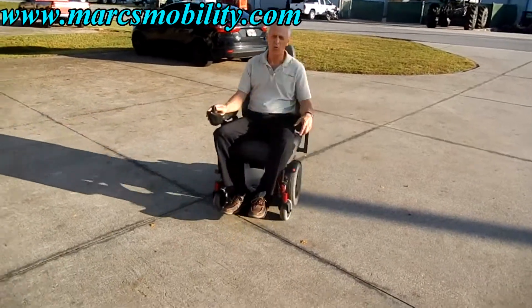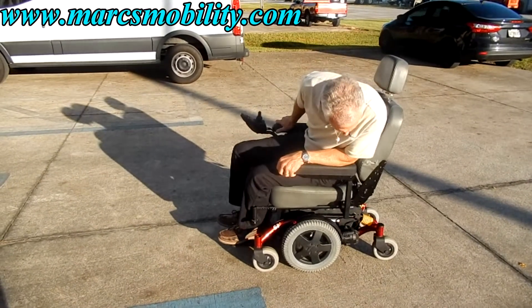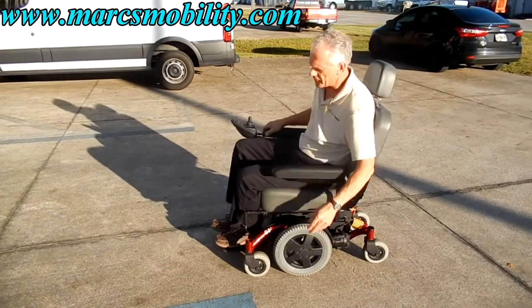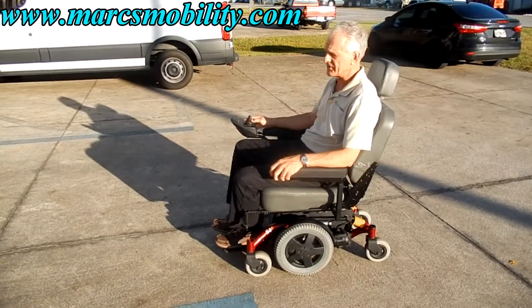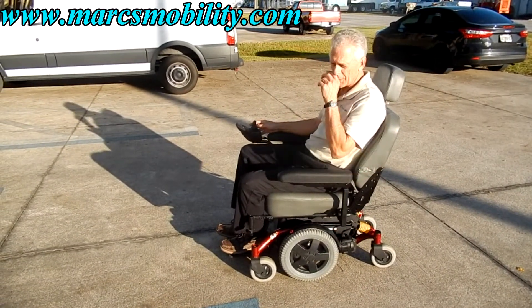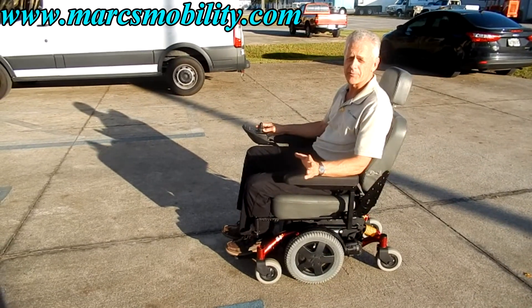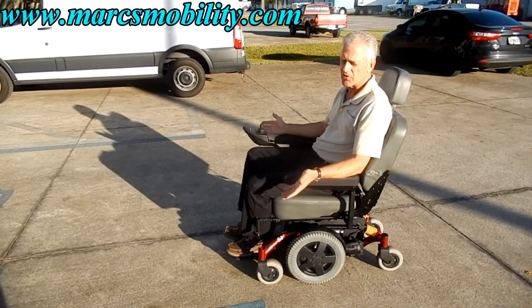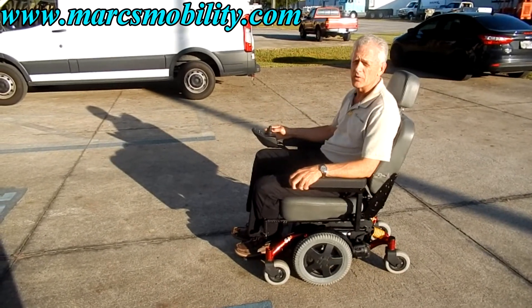As you can see, it does very well in the grass — great suspension. I was trying to demonstrate the suspension on the chair. Powerful motors. Other than this little gash right here, this is a fantastic chair. So give us a call — I'll have this chair at a lower price just because of this, and it was used for three to six months. So if you're looking for a second chair or this is your main chair, this would be a really nice chair.